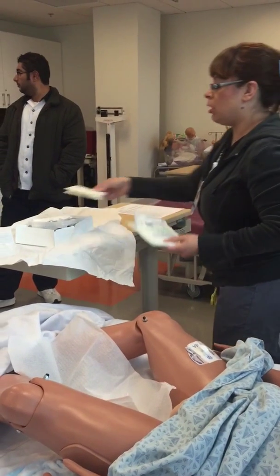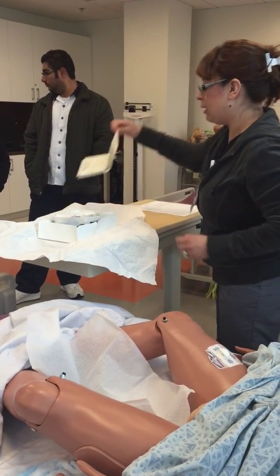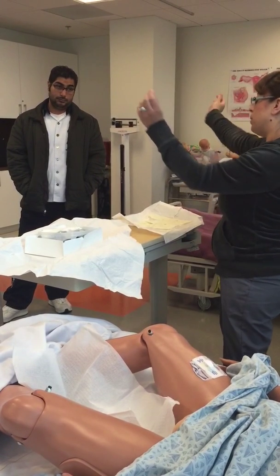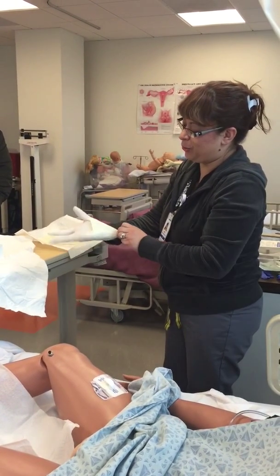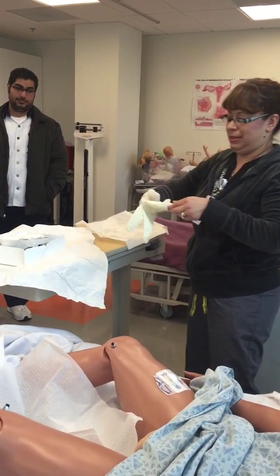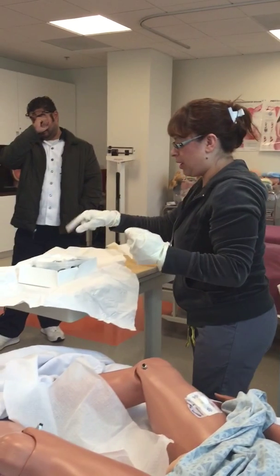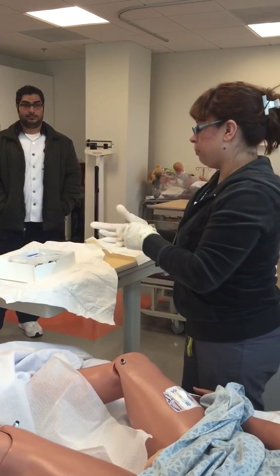Okay, I'm going to place this here. Normally, that's exactly how it should look when you open that package. I'm going to grab my gloves. This is the part where we check to make sure that you're able to apply your gloves sterilely. Oh man, these are humongous. All right, good luck to me. I already have my little trash bag. I really don't use this one, so I can just get rid of it.